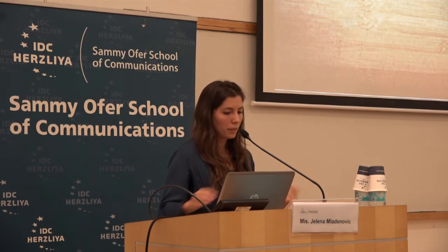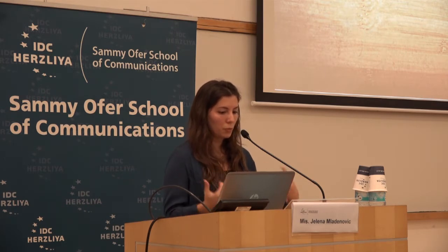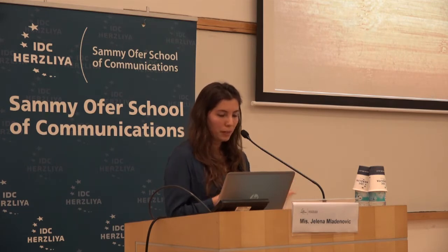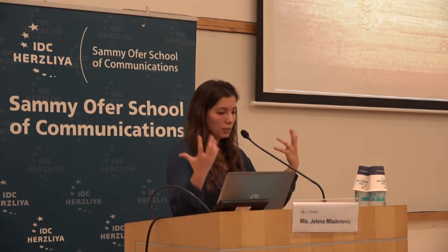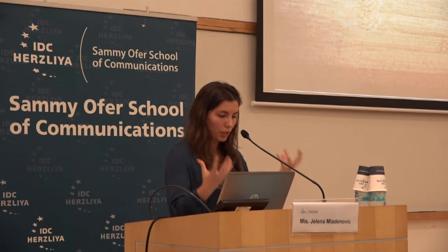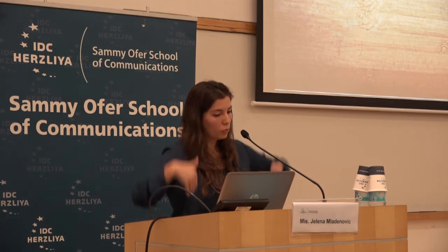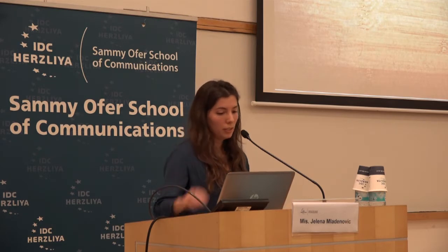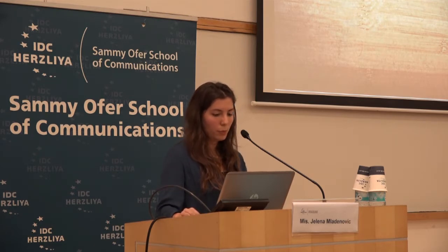And the same goes for the exercise, which means that if someone is imagining hand movement in the motor imagery paradigm for control, if they're not so performant with imagining hands, maybe we can switch to imagining foot movement or tongue or other proposed exercises that exist.